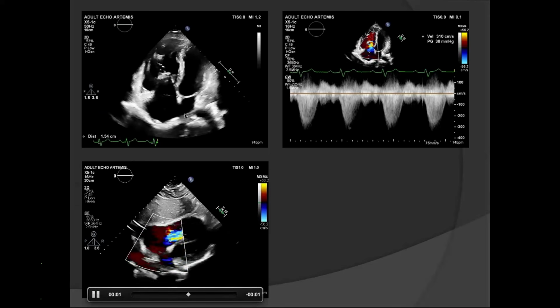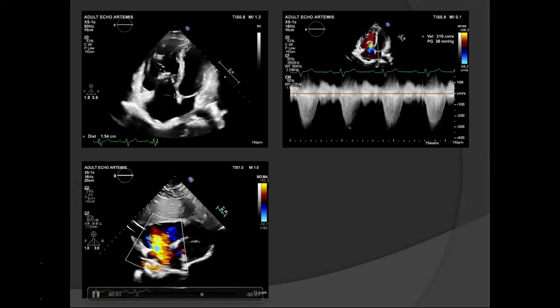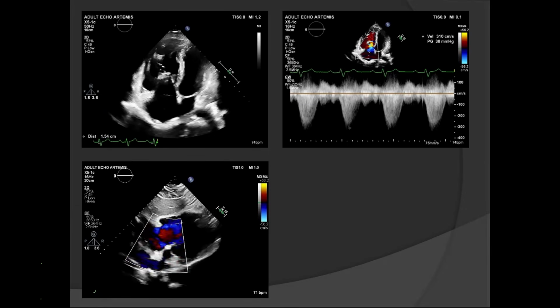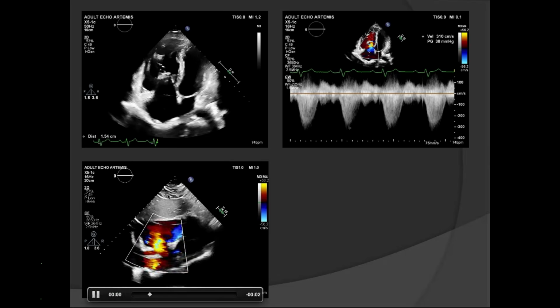Yeah. So these are other views. We have to measure the distance between the mitral and the septal tricuspid leaflet. Here it is 15 millimeter. TR is low pressure TR, not very high pressure. But interestingly, in the subcostal view, you also see that there is a shunting happening from left atrium to right atrium, and there is an associated ASD also.